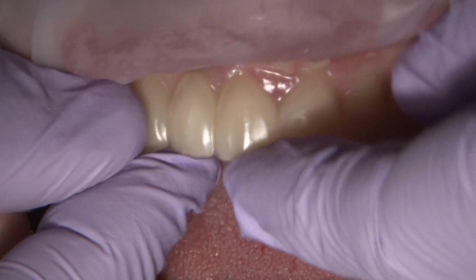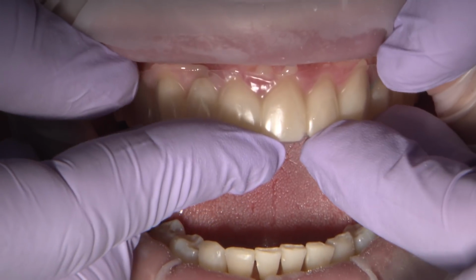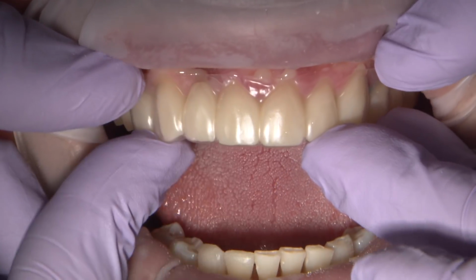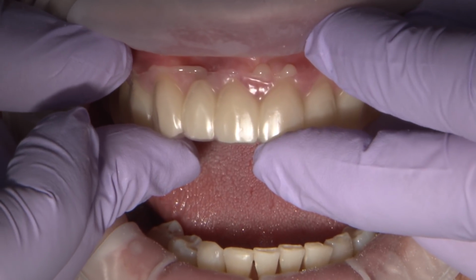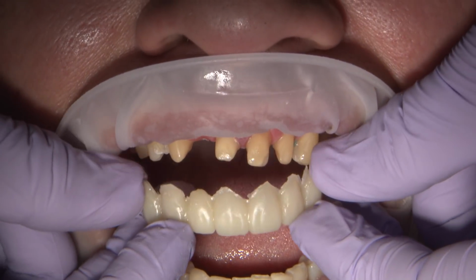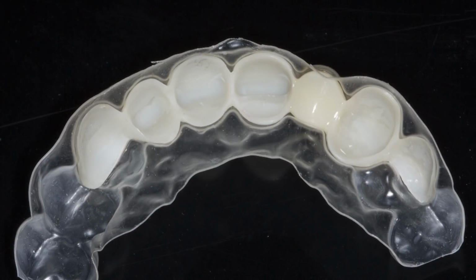Here is a useful tip. When handling the lab-made biotemps, to aid in proper orientation during reline, I recommend the use of the fast stent that the lab provides. Without it, since the Biotemp CAD temporaries are very shallow, there is always a risk of creating protruded temporaries that will look proclined or bulky if oriented incorrectly during the reline.